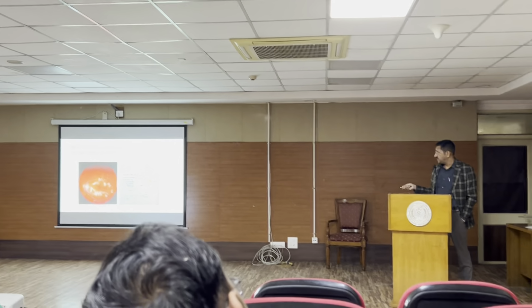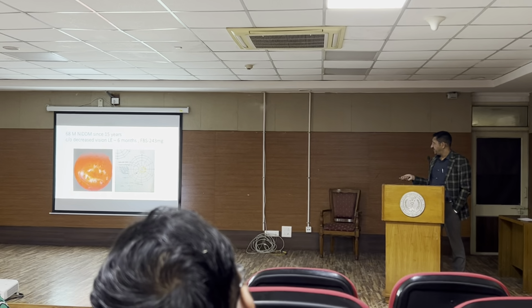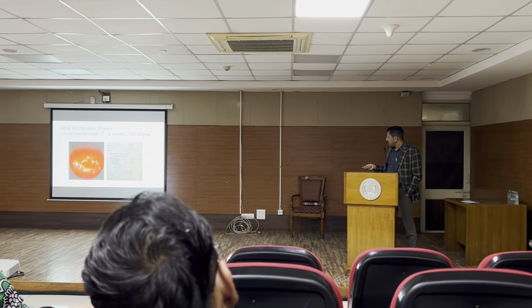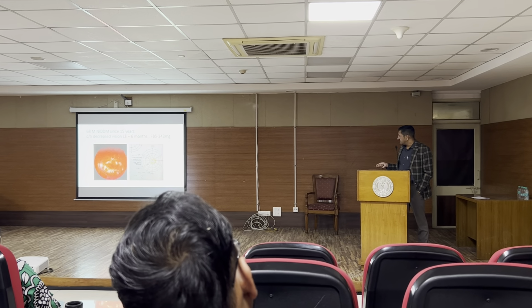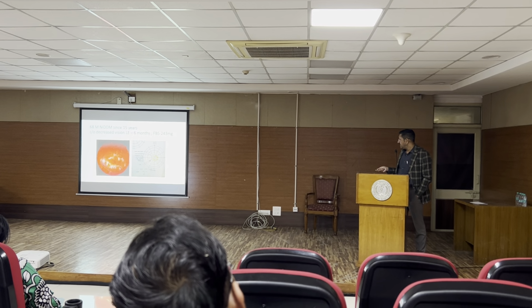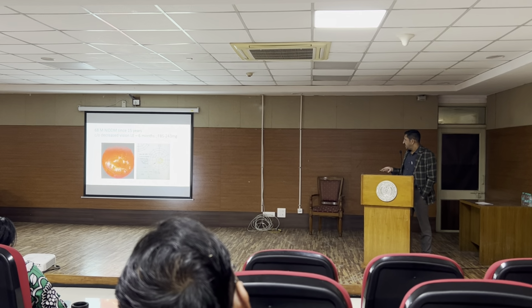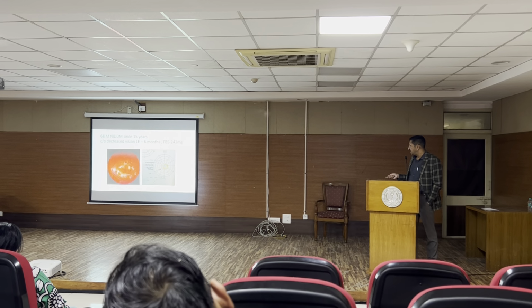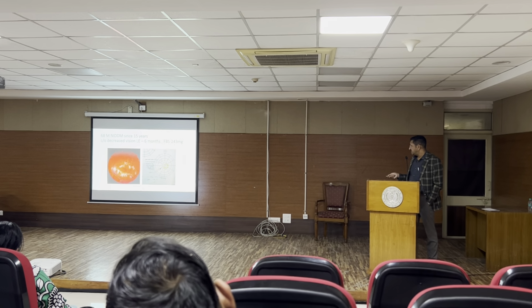So then you start with fundus. In the fundus, you will describe, sir, in this patient, media is clear, grade 1. Disc is normal in size and color. Cup disc ratio is about 0.45. Neuroretinal rim is healthy. In the macular area, there are yellowish, discrete, multiple hard exudates scattered all over the macular area.